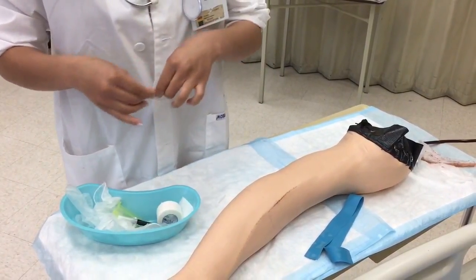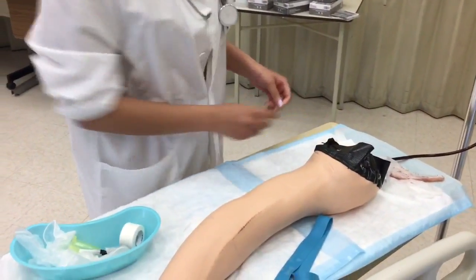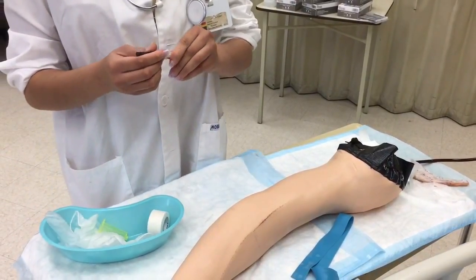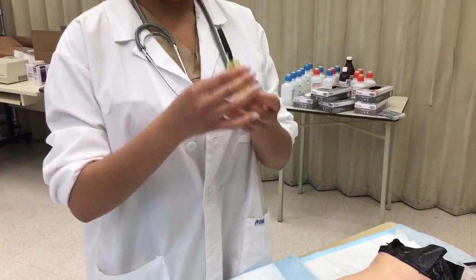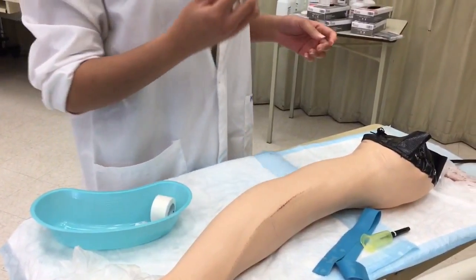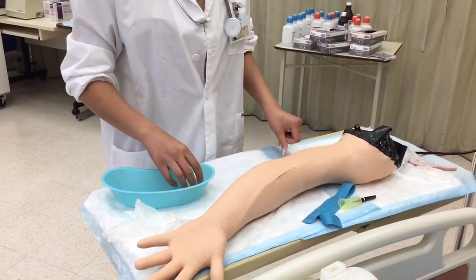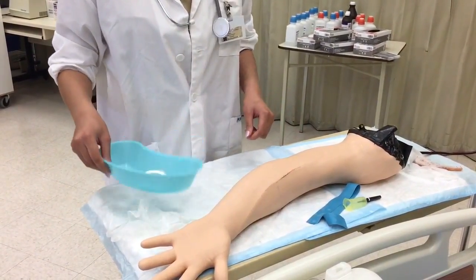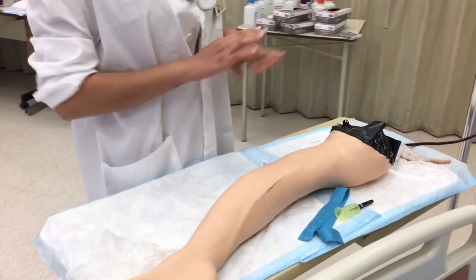Now I'll start preparing my supplies. I like to take a piece of tape and put it across my gauze so I can quickly stick it around the patient. Then prep the needle. I also have my gloves here. In a real hospital, the patient's name and information would already be on the vials, but we're in the lab. I have a kidney basin for my supplies as well.